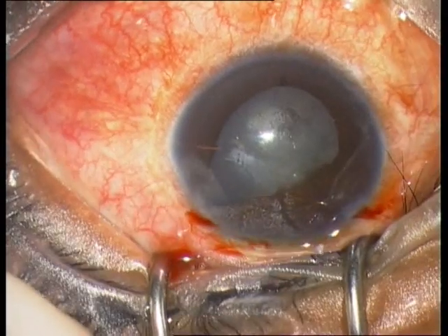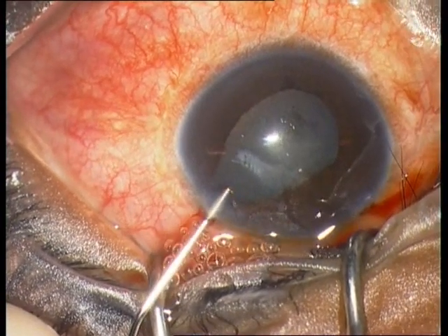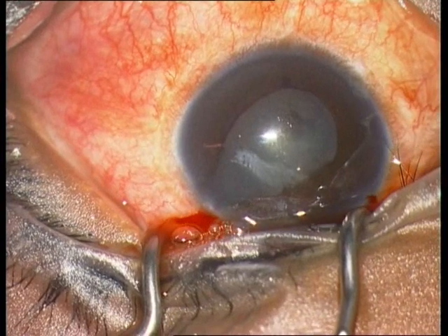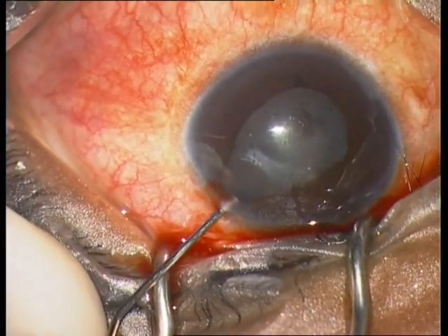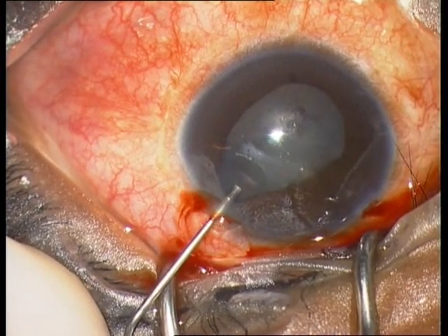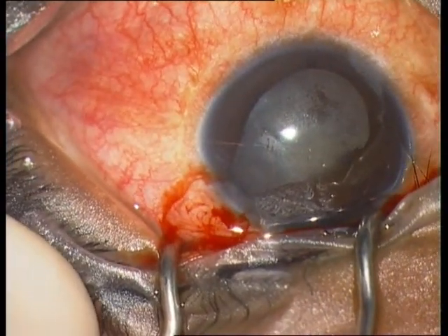I performed two paracenteses at 10 and 2 o'clock. The next step is the injection of vision blue. The problem with this eye is that the anterior chamber is very shallow due to pressure from behind.